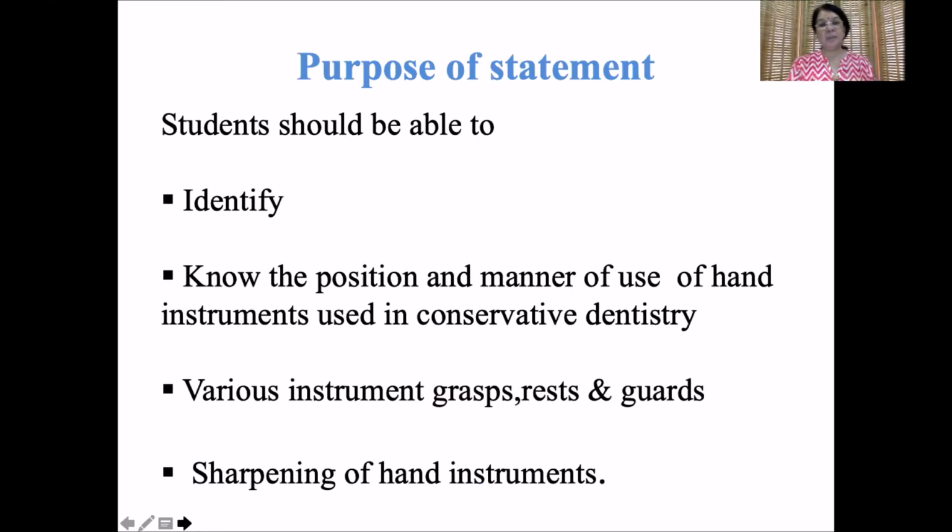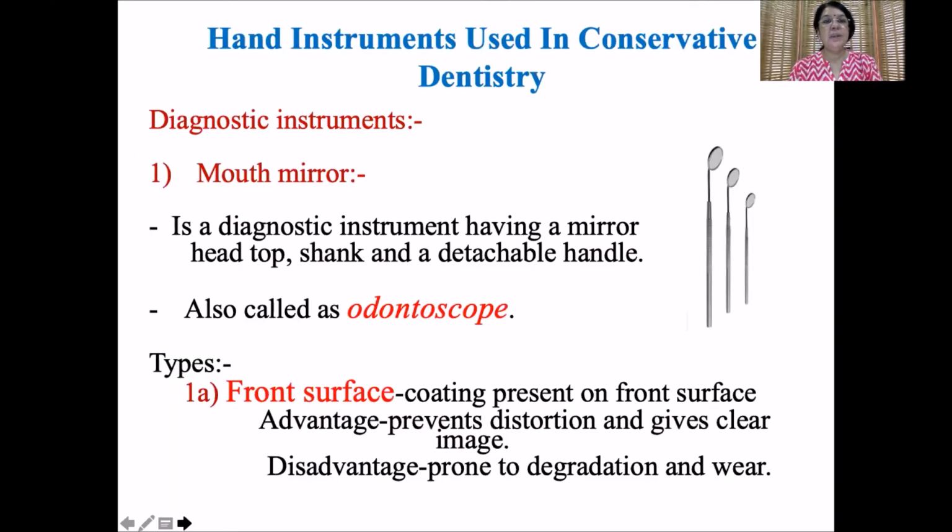Last time we discussed the instruments, and I told you how important instruments are to us and how you should identify or classify them. Instruments are one question you will definitely get every time in your exams, so you should be thorough with them. In this lecture, we'll be talking about different types of instruments. This will again come as a short note, either on diagnostic instruments, or they might ask you to write about one instrument like a mouth mirror or tweezer.